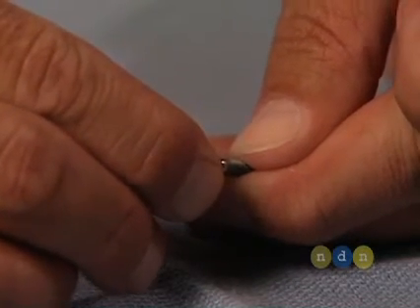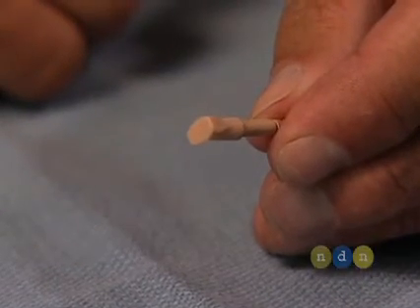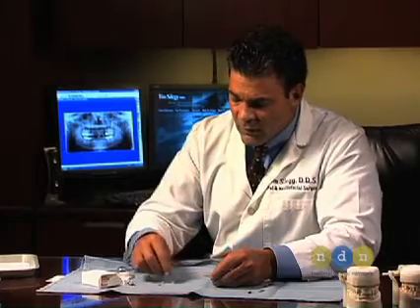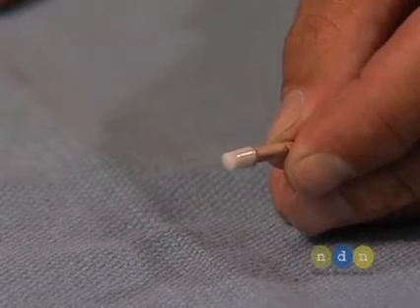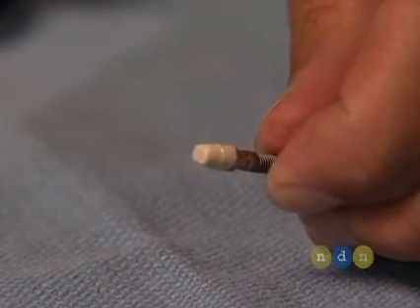The snap cap will then release from the abutment, and a laboratory analog can be placed inside. This can be used to fabricate the model by your lab technician. Also delivered with this kit is a white waxing coping that the laboratory technician can use to fabricate the final crown. A temporary coping is also included and can be used to fabricate an immediate provisional.